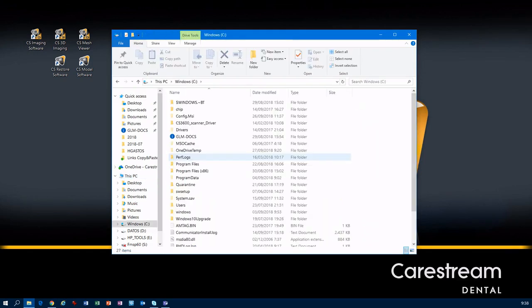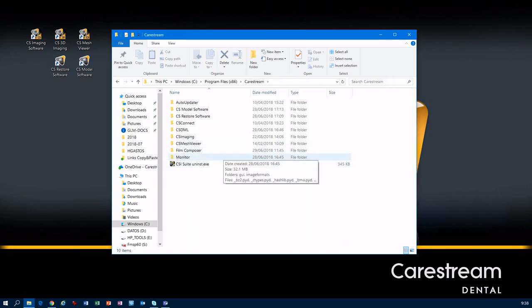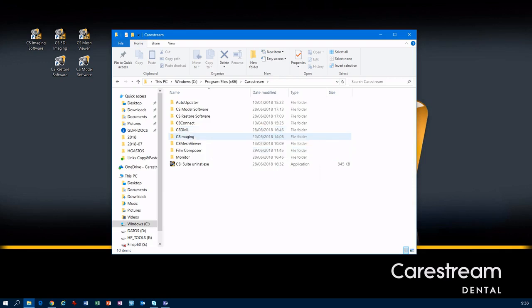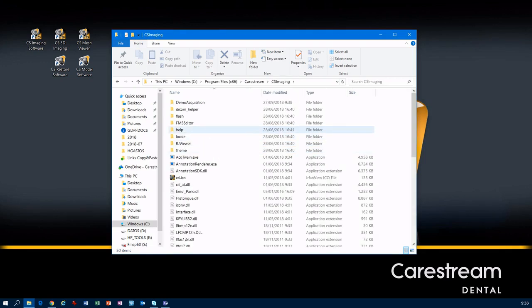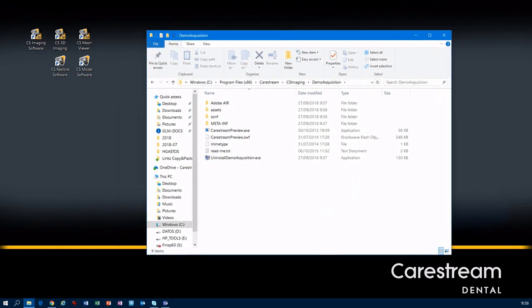In Program Files x86, we have the Carestream folder. In the Carestream folder, we have the CS Imaging folder, and here we have the demo acquisition installed. Just open it.